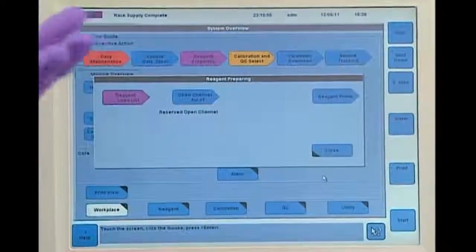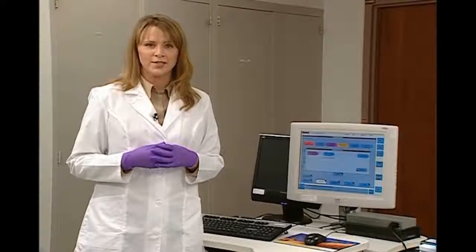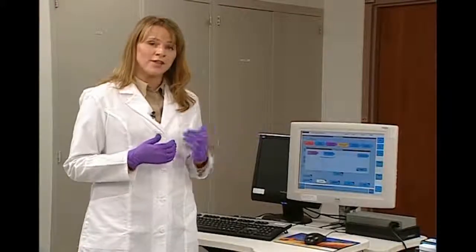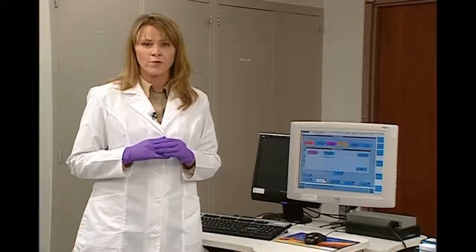And I will get two reports. One is a load list and the other is the unload list. The benefit to this is now the operator does not have to look at the software at each individual assay to determine whether or not we have enough reagent to get through a full 24-hour period.